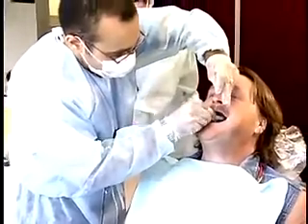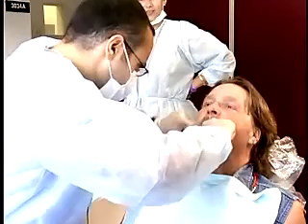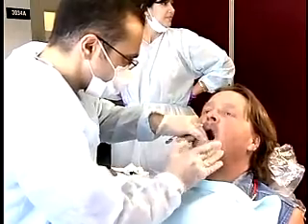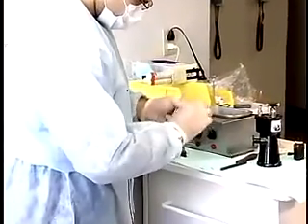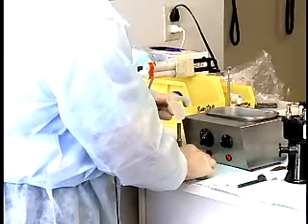Reflect the cheek with the mouth mirror and seat the tray. Grasp the cheek at the corner of the mouth and draw outward and upward. Massage inward, forward, and backward. Remove the tray, chill it in ice water, and inspect. Do not remove excessive compound that has flowed into the tray. This will be done later.